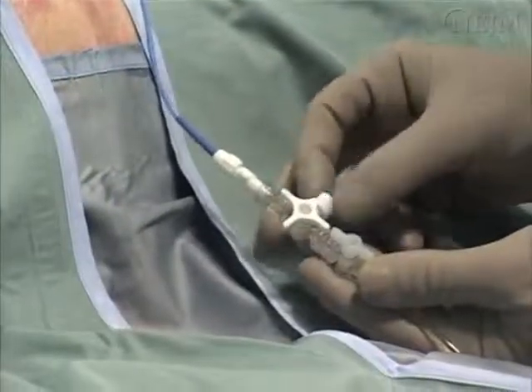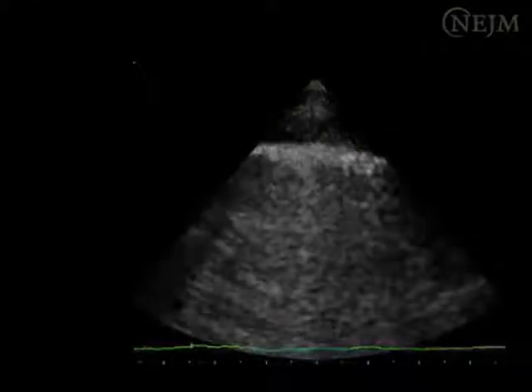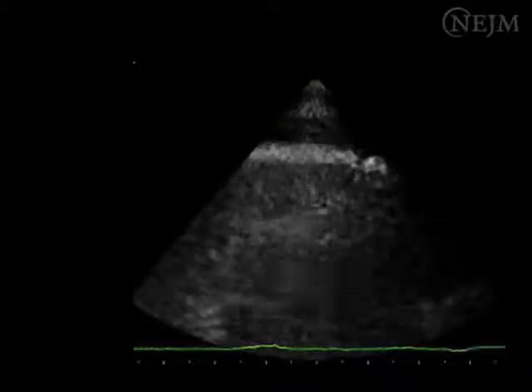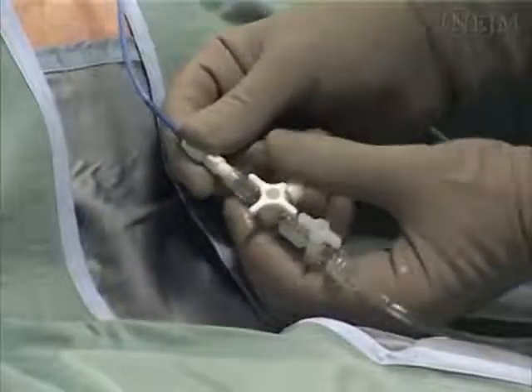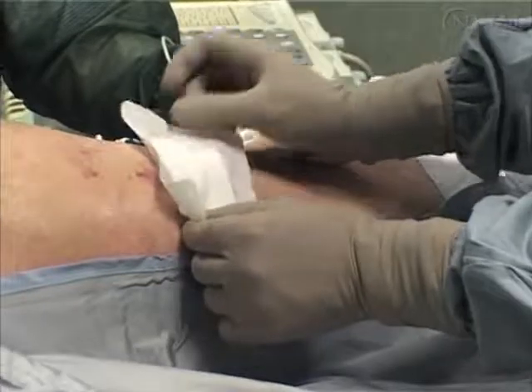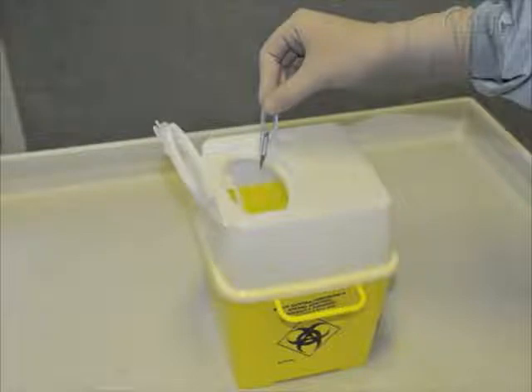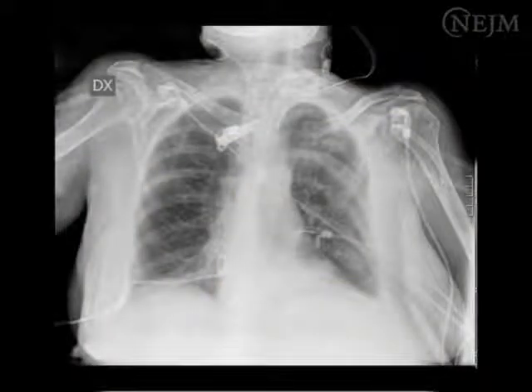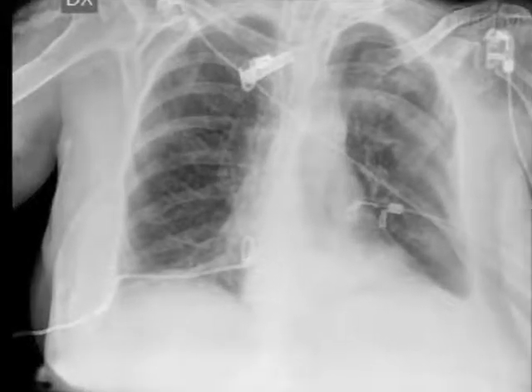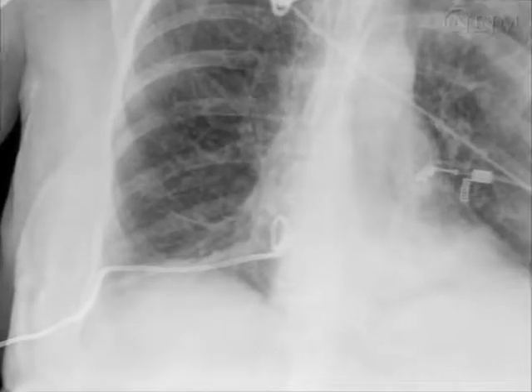Be certain that you have the stopcock in the correct position. Now perform a post-procedural check with the ultrasound unit to confirm the success of the procedure. Finally, make sure that all connections are secure to avoid accidental disconnections and entry of air into the pleural space. Secure the catheter with a surgical suture. Clean the surrounding skin and apply a sterile dressing. Make sure that the catheter is not bent or occluded by the dressing. All sharps must be properly disposed of according to local policy. A standard chest radiograph should be obtained after completion of the procedure to confirm that the catheter is correctly positioned and to rule out possible complications.